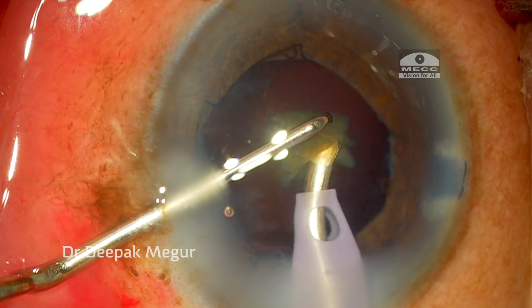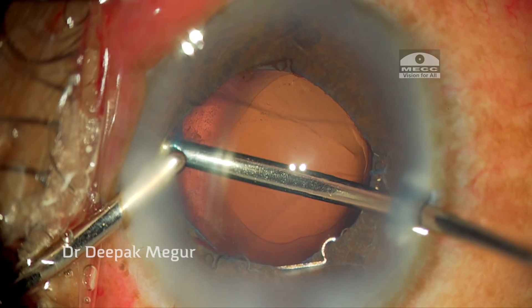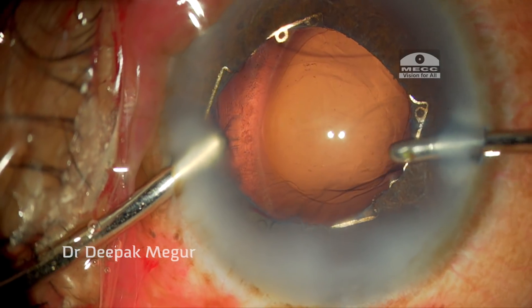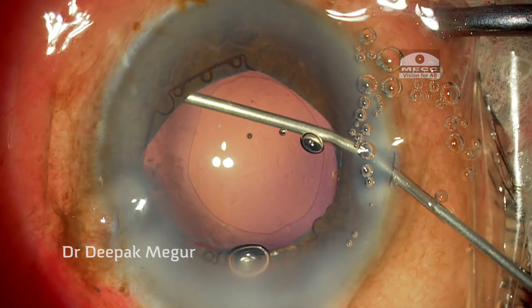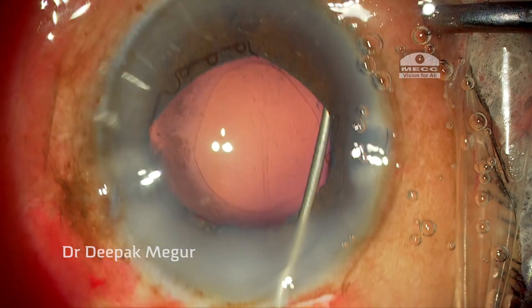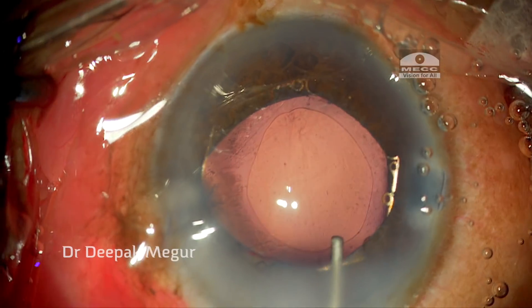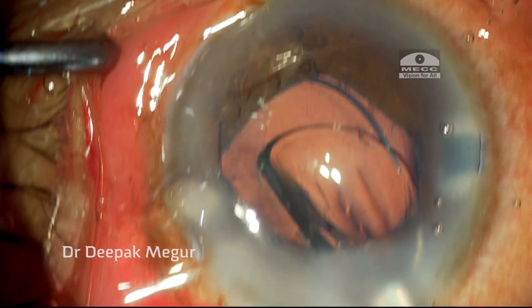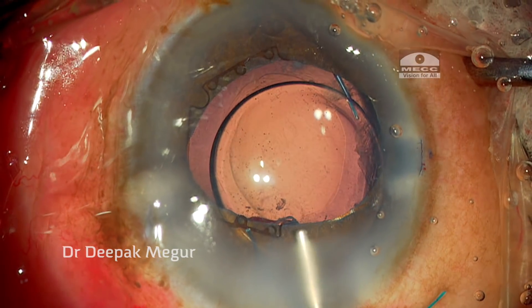Having removed all the nuclear fragments, I go in with my bimanual cannula to check for any remaining cortex. I can see the bag is extremely loose here, but at this moment I feel relieved — the majority of the job is done. Now I create some space under the iris and above the anterior capsule using sodium hyaluronate. I place the lens in the sulcus — the haptics in the sulcus with an optic capture. The lens is gently maneuvered into the ciliary sulcus just above the anterior capsule. This is a multi-piece lens that I am using.